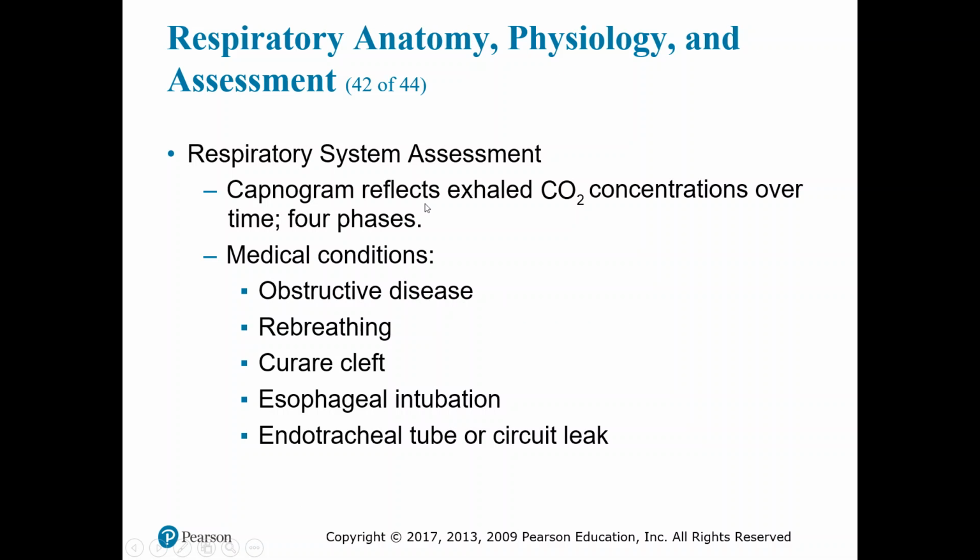The capnogram reflects exhaled CO2 concentrations over time, and that time is broken up into 4 phases. And I'm going to describe them to you as I can't show you. I tried to draw on here earlier and it doesn't work for whatever reason until I get that figured out. But you can easily look this up as well.